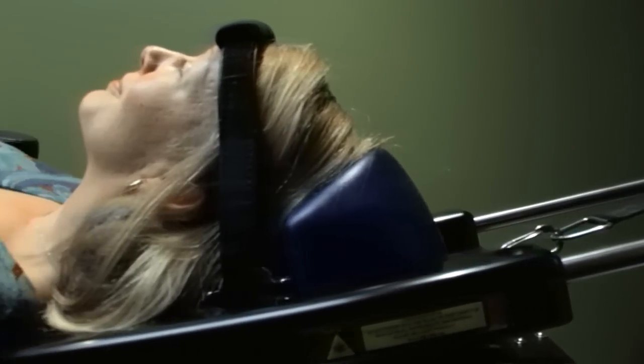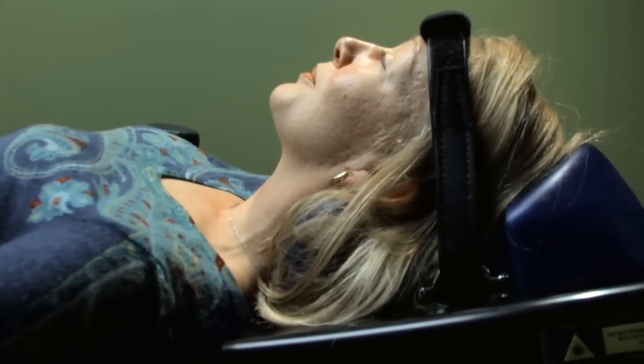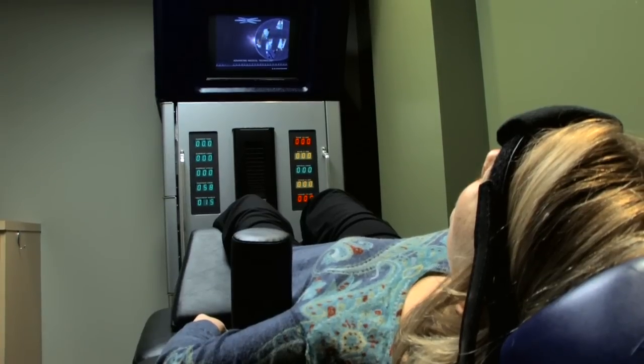The cervical or the neck unit is typically for people who have arm pain, numbness, or tingling as a result of a disc problem. Often it's a bulging disc or stenosis in the neck due to chronic degeneration, otherwise known as arthritis. And those are the best candidates. Sometimes they actually have a herniated disc. Those are based on MRI results. And typically they are getting arm pain, may present as shoulder pain and or neck pain. There may or may not be numbness or tingling.